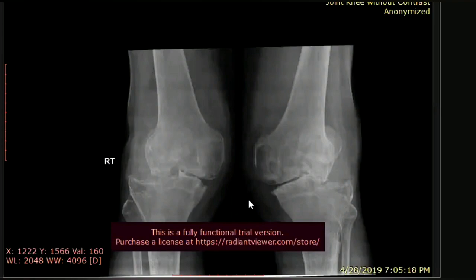If as a candidate of FCPS or FRCR you appear in the exam, I would advise that if both joints are involved and you see erosions, please always think about erosive arthritis and not osteoarthritis.